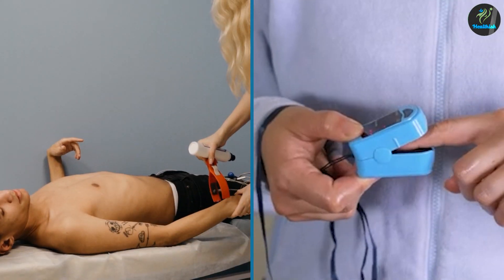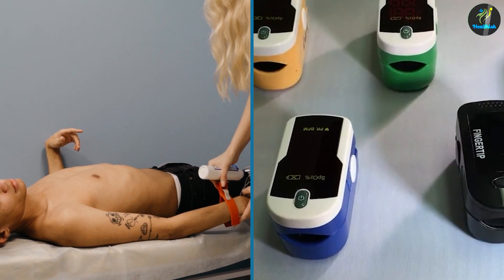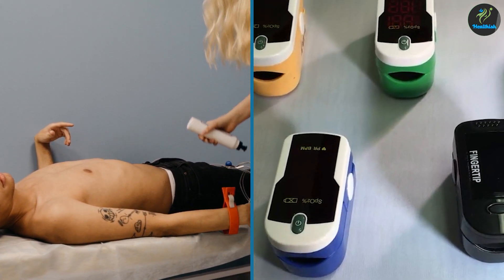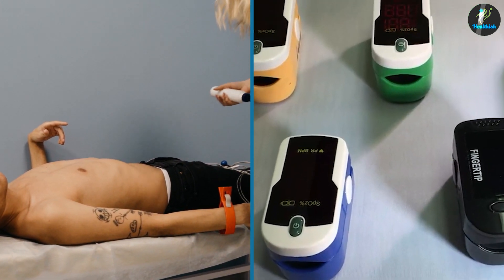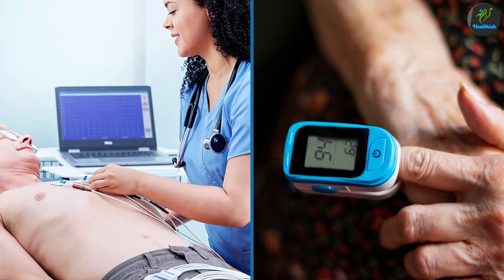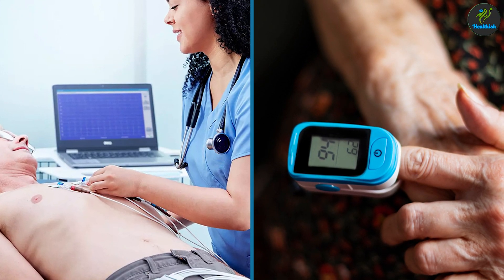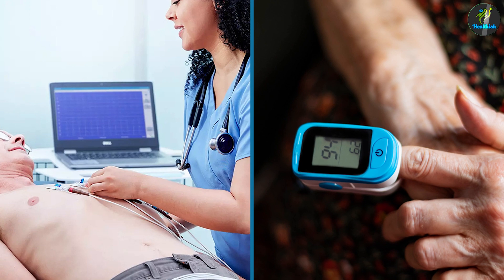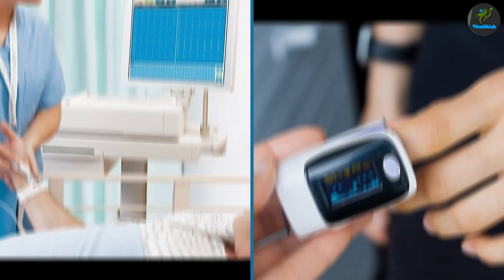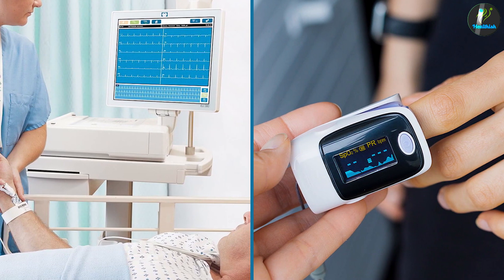ECG and pulse oximeter are two important medical devices used for monitoring vital signs. Both devices are important in diagnosing and monitoring various heart and respiratory conditions. While both devices provide accurate measurements, their accuracy may be affected by certain factors, such as poor circulation or the use of nail polish.